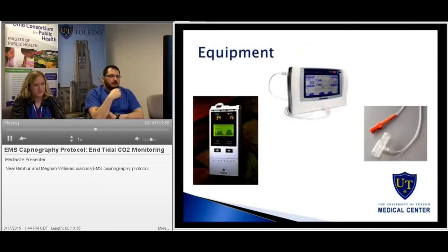This is simply a picture showing different types of devices that will measure CO2, and you can see that there's the numerical and the visual picture of the waveform, and there is a picture of what the tubing looks like.